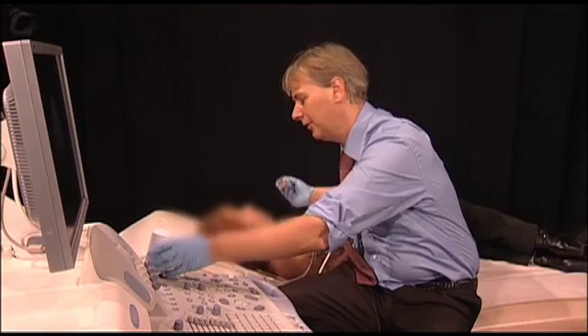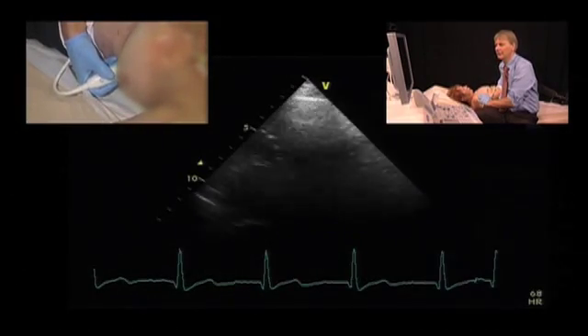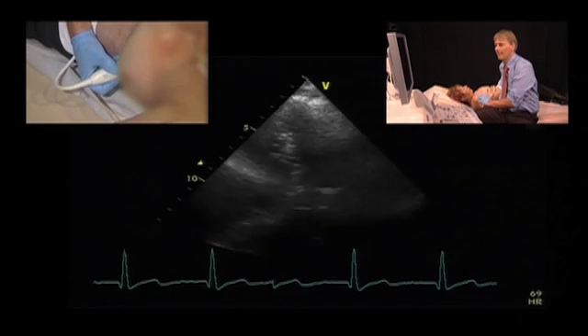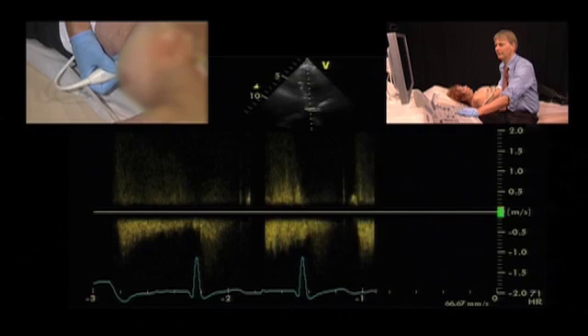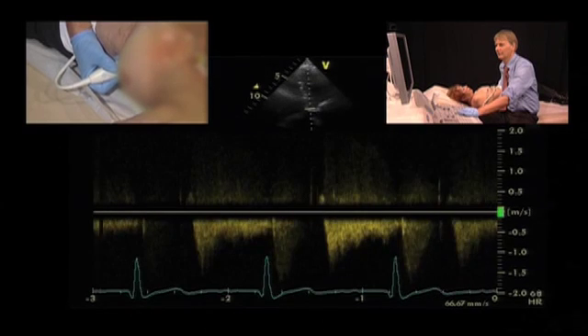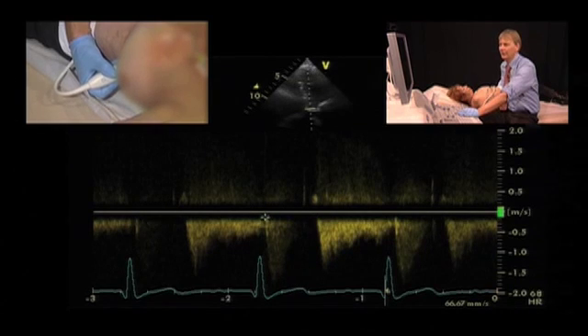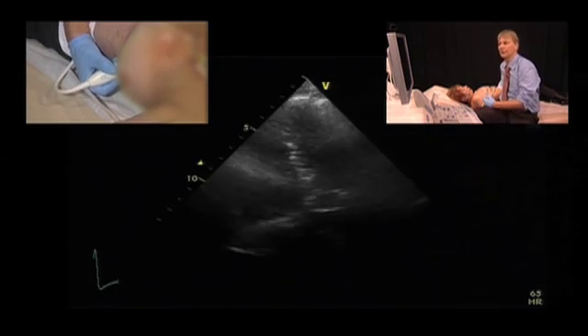Another helpful feature is looking at the continuous wave Doppler spectrum across the bioprosthesis. What we do not have is the very prominent closure, opening, and closure artifacts that we would have in a mechanical prosthesis. So this is a normal pattern, similar to the pattern you would have in a normal aortic valve or in an aortic stenosis patient.